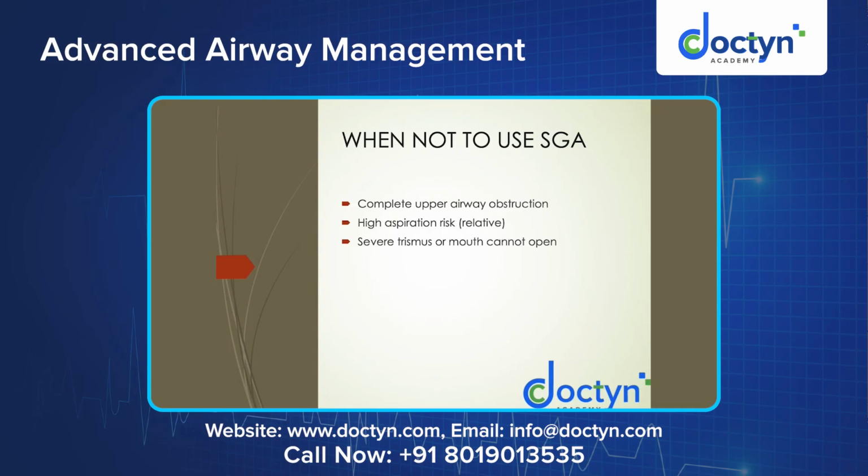And if there is a higher aspiration risk, but it is not an absolute contraindication, it is relative. Just try to avoid it if there is a full stomach patient. It is not that your intubation has failed, but just because of the fear of aspiration risk, you would completely avoid supraglottic airway insertion. No, it is not like that. You have to weigh the risks and benefits between inserting a supraglottic airway or avoiding it, and prefer avoiding it when there is a risk of aspiration.